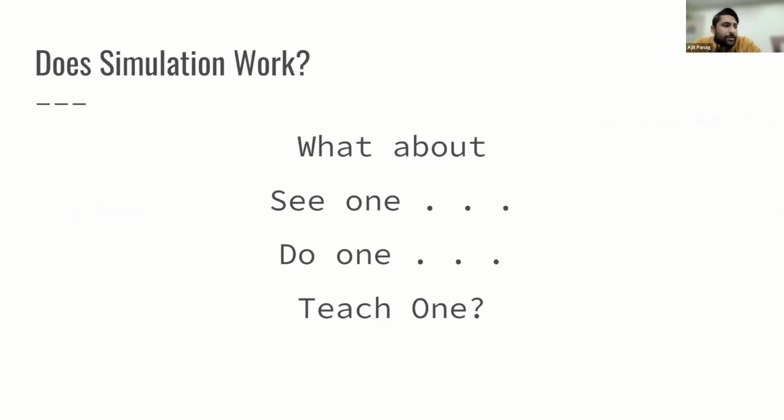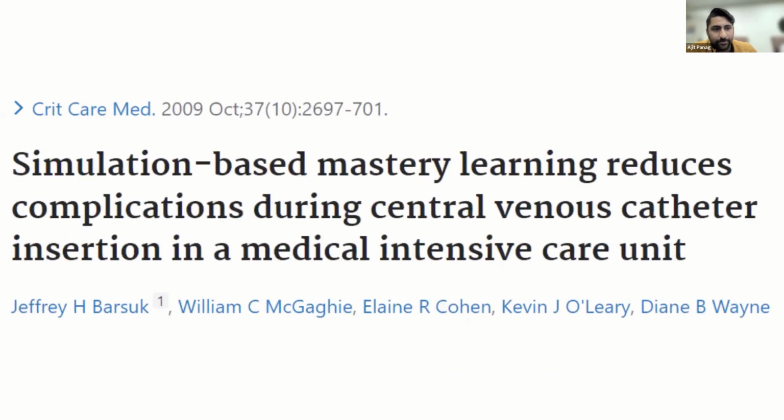So does simulation work? So what about see one, do one, teach one? This is probably not the best way, as we probably all have experience with, to learn how to do procedures anymore, especially with the wide variety of simulation that we have access to. So this was a study published in Critical Care Medicine called Simulation-Based Mastery Learning Reduces Complications During Central Venous Catheter Insertion in a MICU.